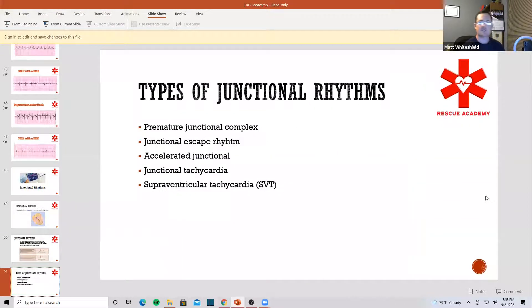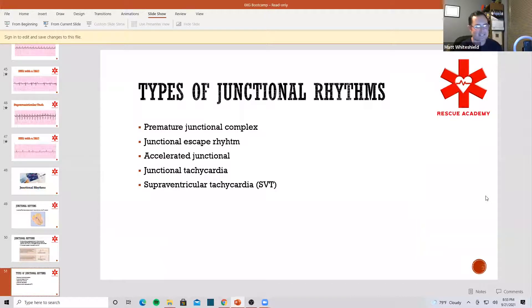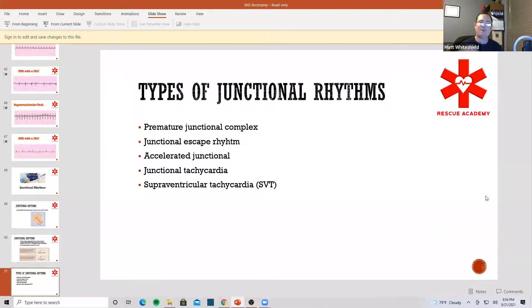It still looks kind of normal. We're going to be talking about PJCs, junctional escape, accelerated junctional, junctional tach, and we have to talk about SVT, which we kind of already hit on.